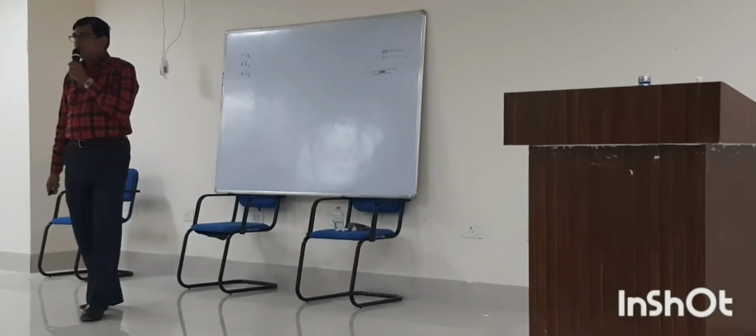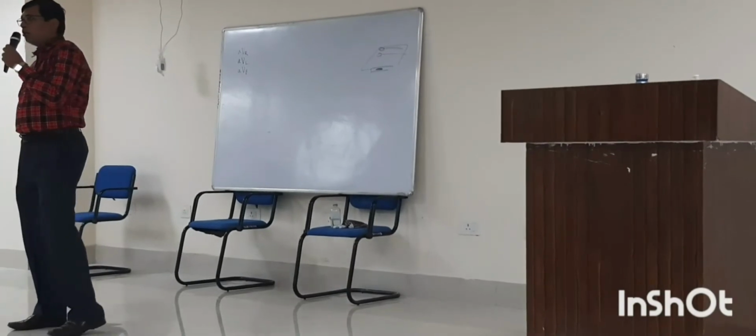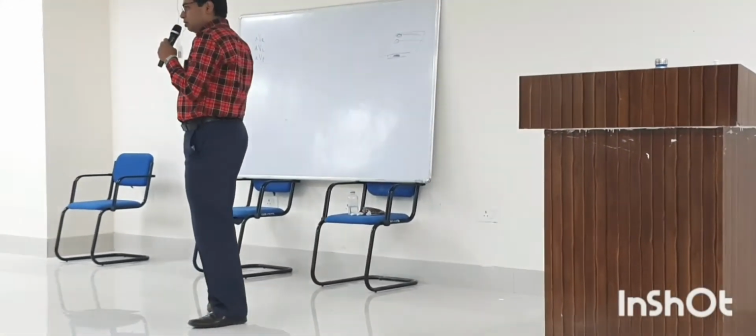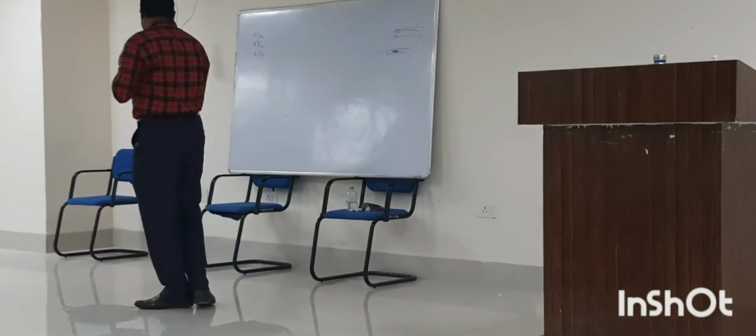Why is augmentation required? To augment the voltage.